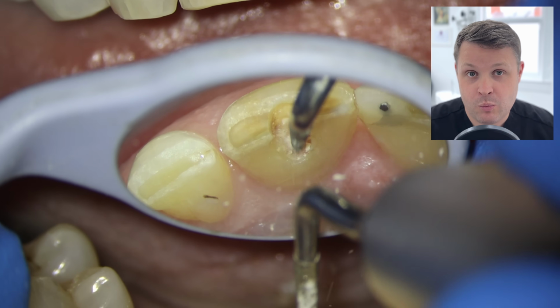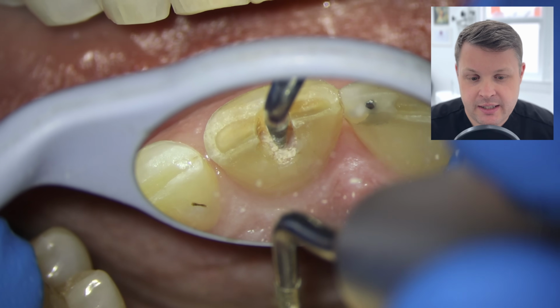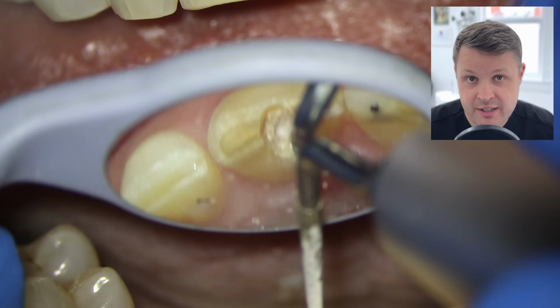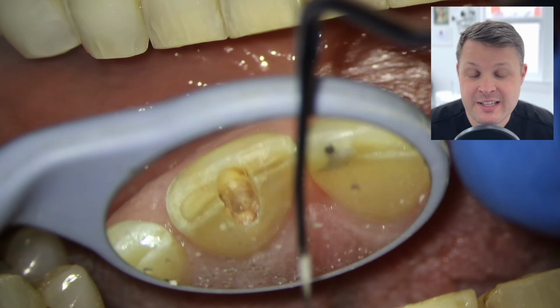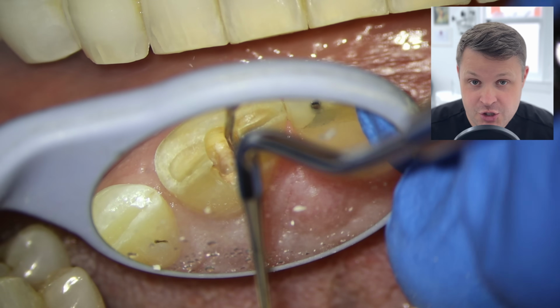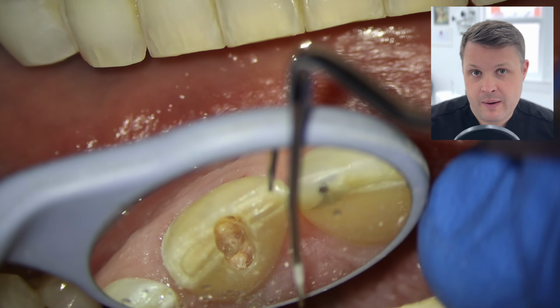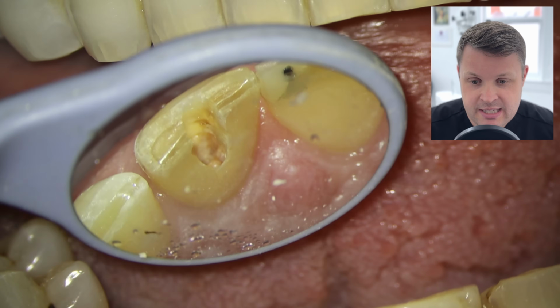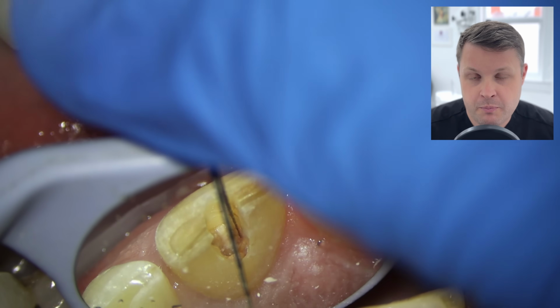But what I would say is, as I was editing this video, I was editing the first half of this appointment, and this is where I saw my reflection in where I was going wrong. So in this case, I'm going palatal, but I shouldn't be going palatal. And here is where, when we do the measurement check with a cone beam CT scan, we can check how deep we should be and where we are.